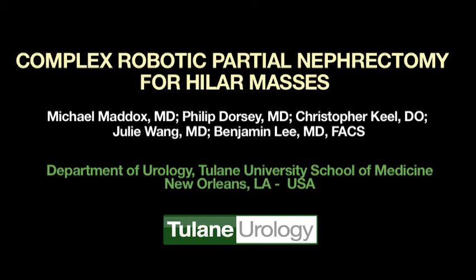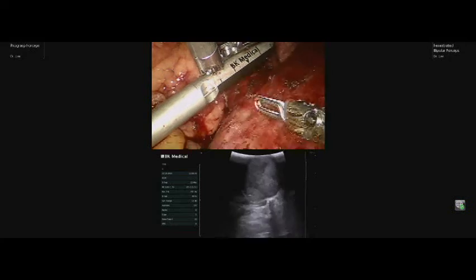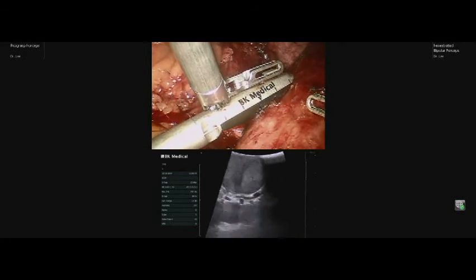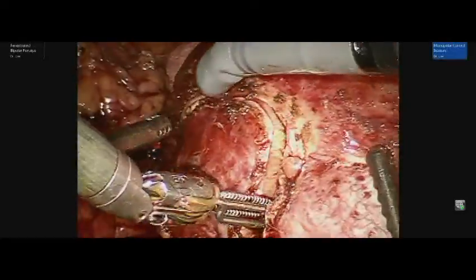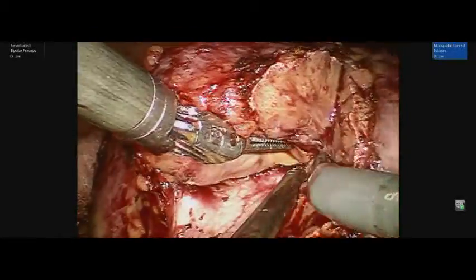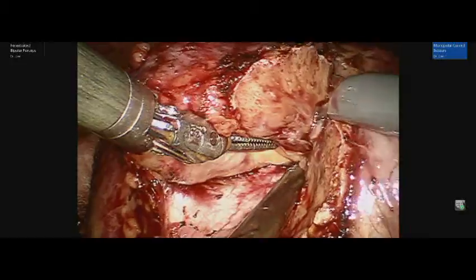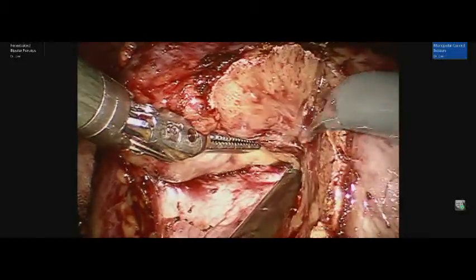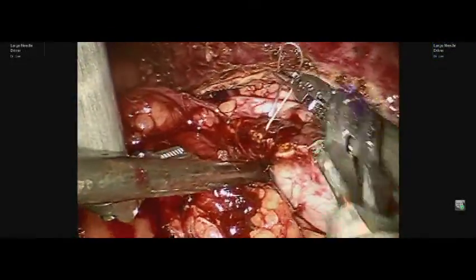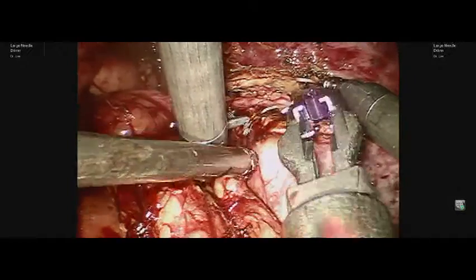We present a video of robotic partial nephrectomy for a right posterior hilar renal mass. Robotic partial nephrectomy has expanded the nephron-sparing approach to renal cell carcinoma. With increased utilization of robotic surgery, we have extended our indications for robotic nephron-sparing surgery to T2 tumors, solitary kidney lesions, and hilar masses.